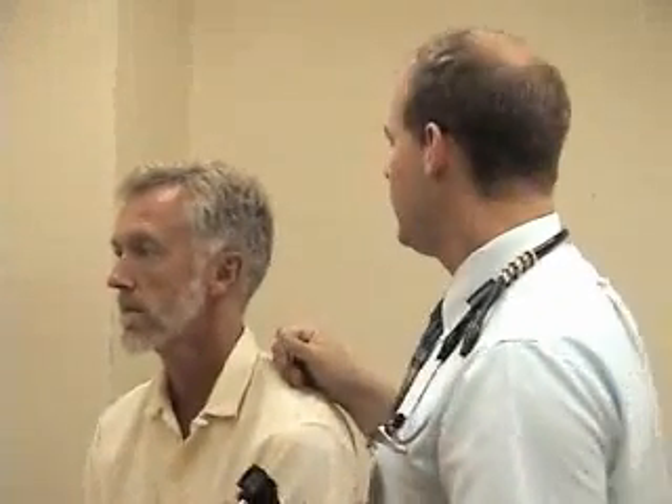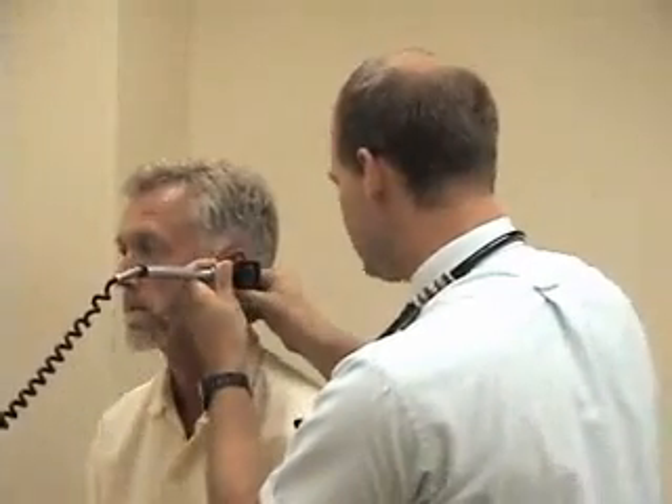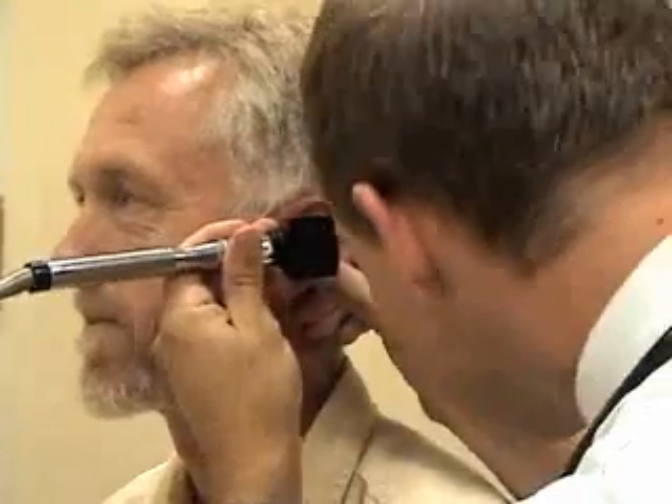There are a lot of different ways that you can hold the otoscope, and all of these were presented to the students in the lecture. My personal favorite is to hold it like a pencil and keep the smallest two fingers of my hand over the temple area just to stabilize my hand. It's helpful especially when examining a squirmy infant, but it can be helpful in adults too. I'm going to move the pinna up and back just a little bit and look my way into the ear canal.